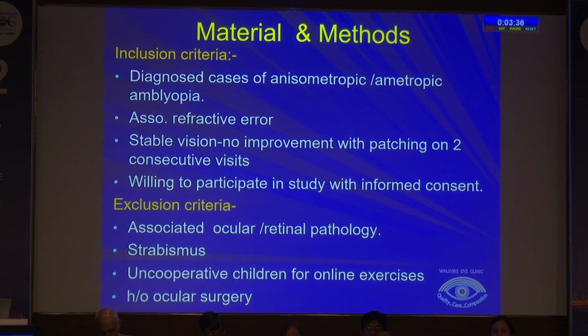And the exclusion criteria: patients with strabismic amblyopia or a history of any ocular or retinal pathology or ocular surgery were excluded from the study.